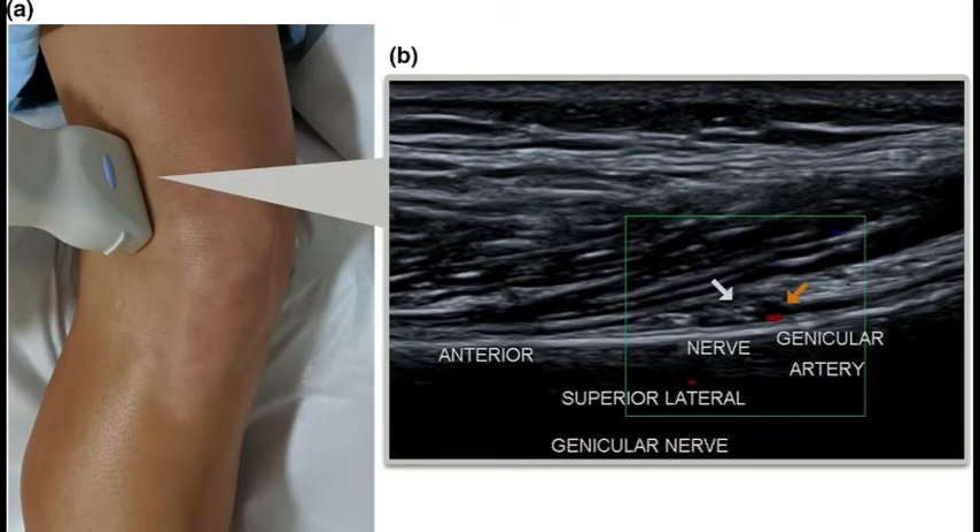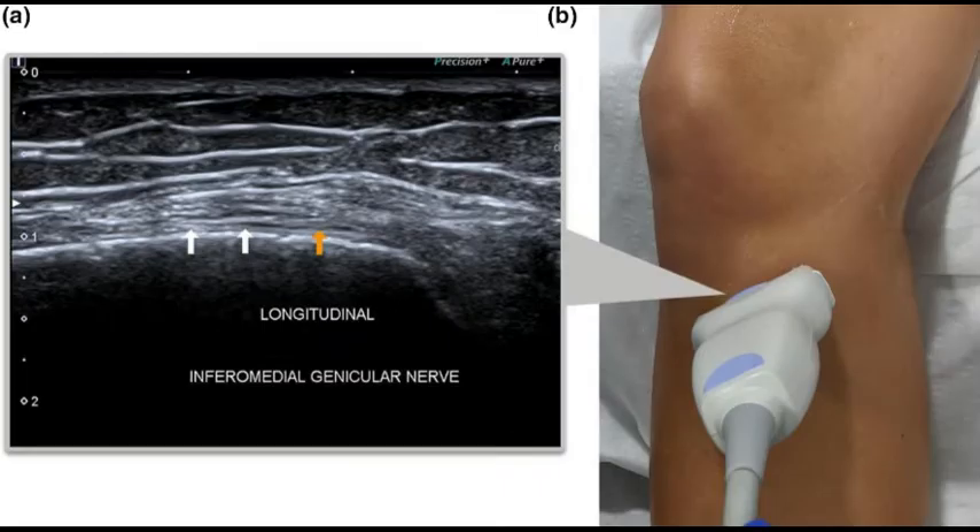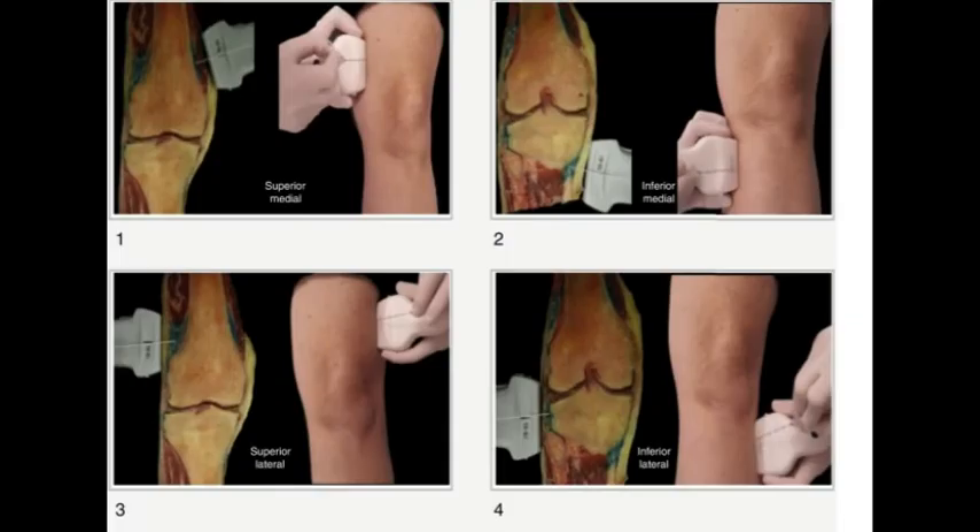For the superolateral genicular nerve, this is our probe position. You can see the vastus lateralis muscle and the corresponding genicular artery. For the inferior medial genicular nerve, we have slightly tilted the probe to get a better image. The probe position shown can also be used in a more conventional orientation.